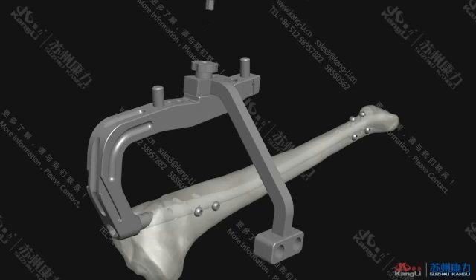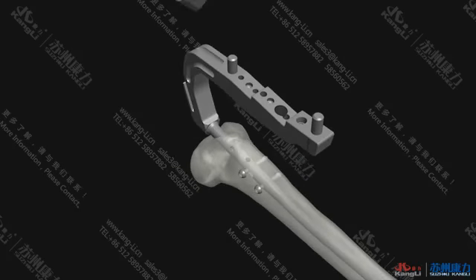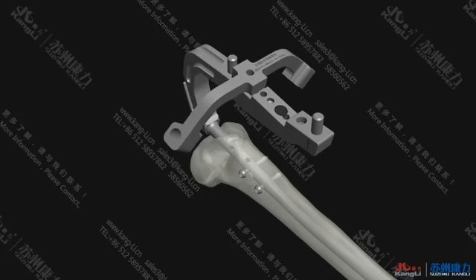Three phi 5.0 locking screws could be placed at the proximal end of the nail of the KTO Tibial Intramedullary nailing system, according to the requirements of the type of the fracture. The detailed operations are as follows. Install the proximal cancellous bone targeting bracket on the holder and screw tight with the proximal targeting bracket lock wheel.